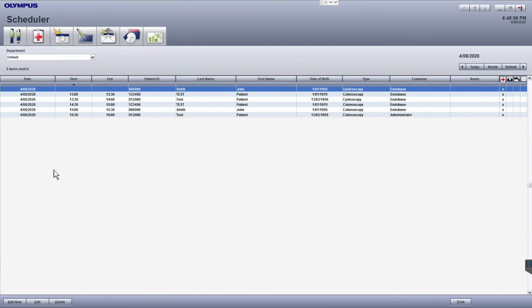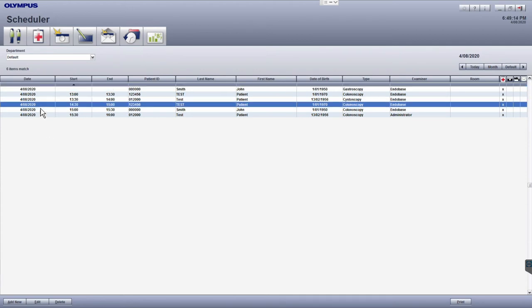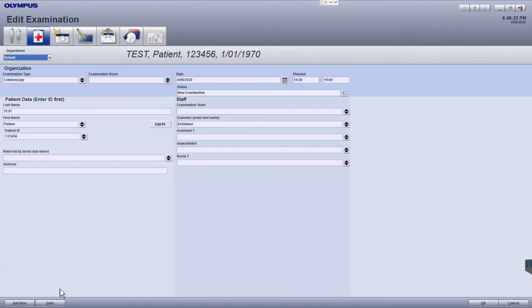To edit an examination, in the scheduler home screen, click on the examination you wish to edit so it becomes highlighted. Then click on the edit button in the bottom left to bring up the edit examination window. Update the fields you wish to edit.